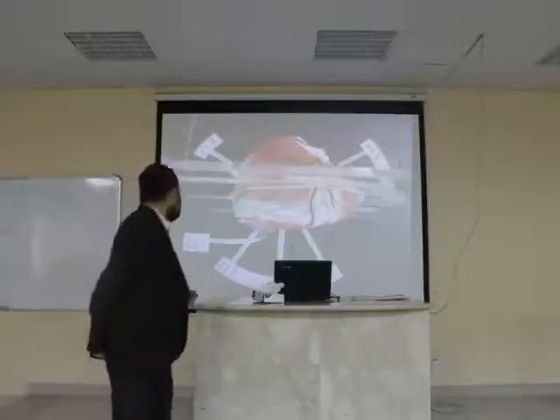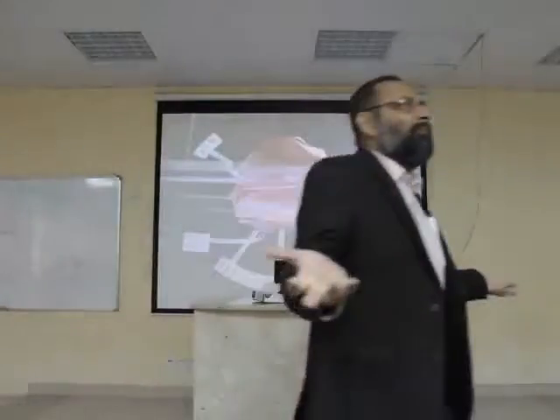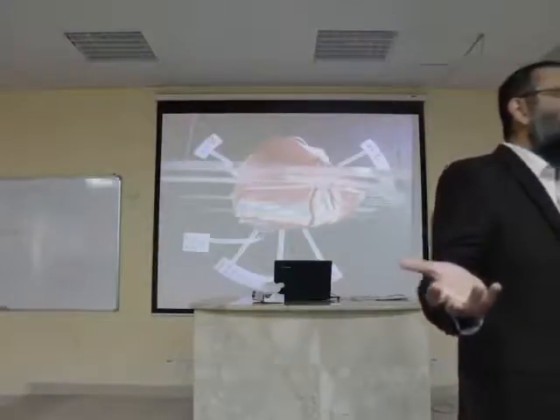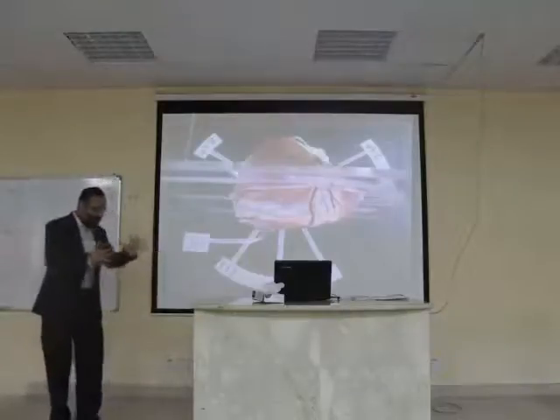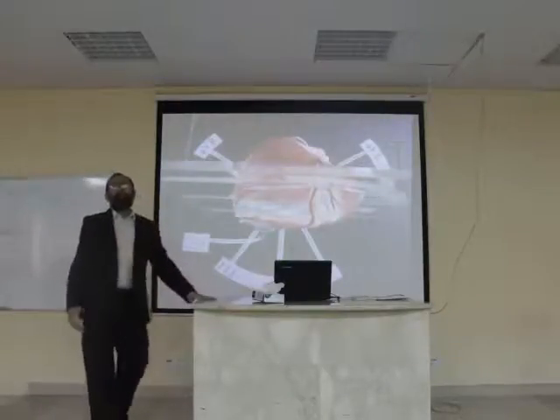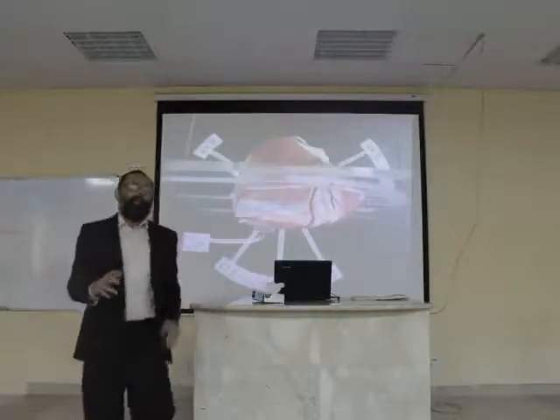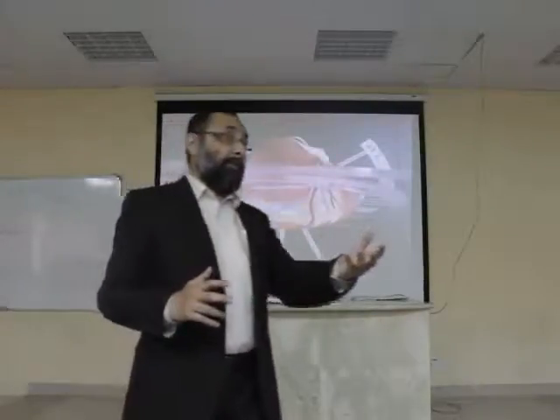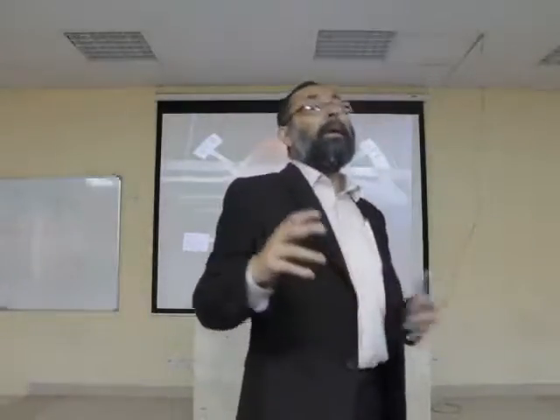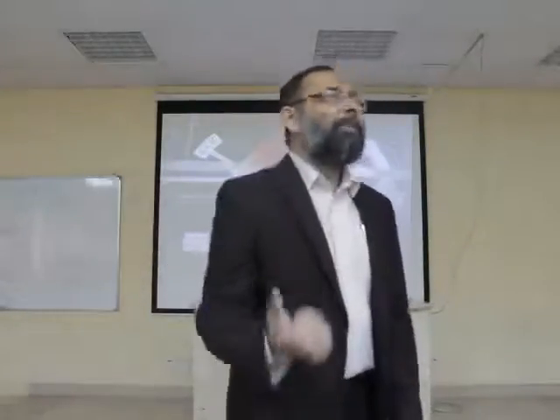What are you left with now? Which lead? AVR. AVR is looking at the heart from this side and the cavity of the right atrium. AVR is a very strange lead. Its significance is not really considered very much, even though it's very important. But in diagnostic medicine, AVR is actually an ignored lead.